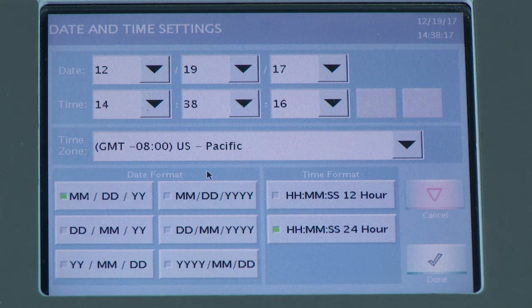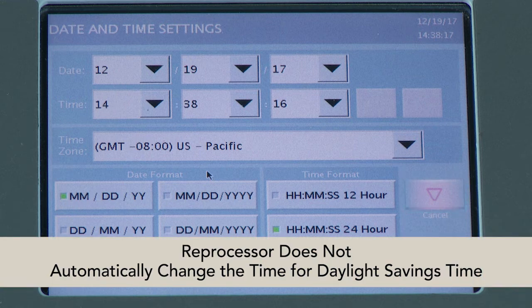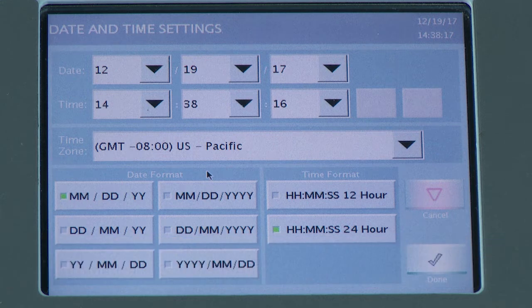Touch the arrows next to each field to change the month, day, year, hours, minutes, seconds, and time zone. Touch the boxes to choose the time and date display formats, and to choose AM or PM for the 12-hour format. Touch Done to save your changes and exit the display. Touch Cancel to exit the display without saving changes. Note, the reprocessor does not automatically change the time for daylight savings time.